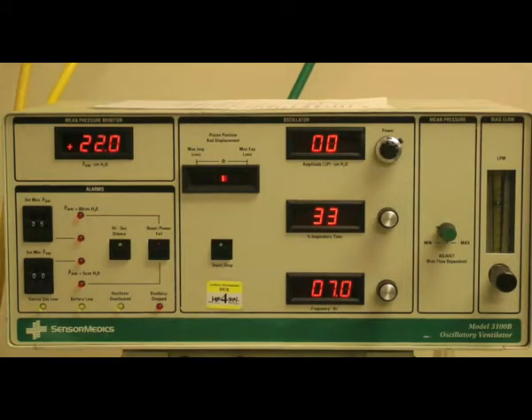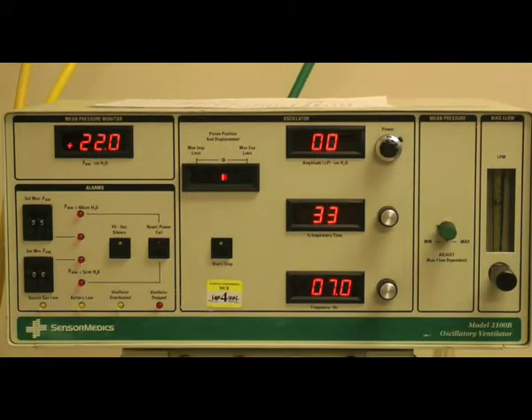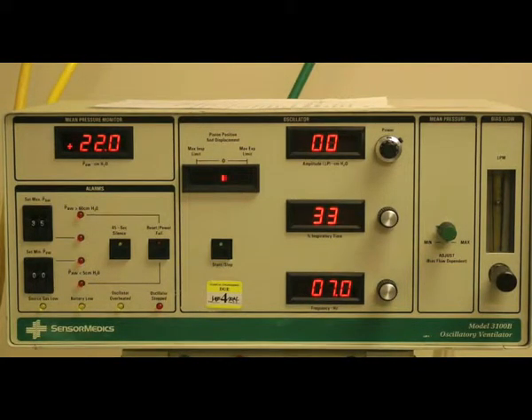We are going to cover initial settings and adjustments for acid-base status, changes in pH and CO2, how they affect your settings, as well as oxygenation management.